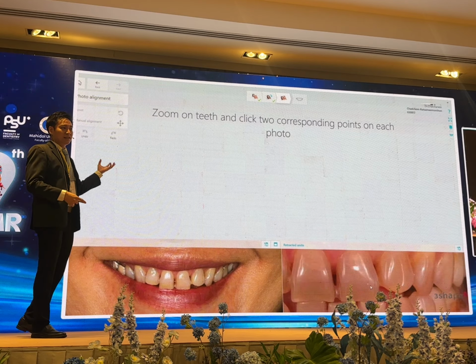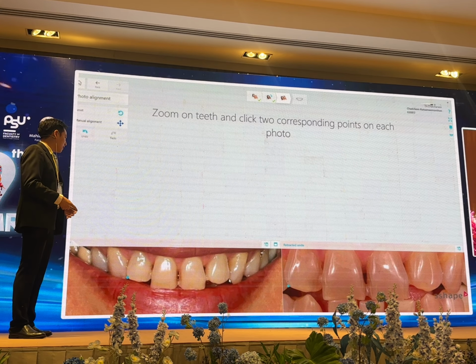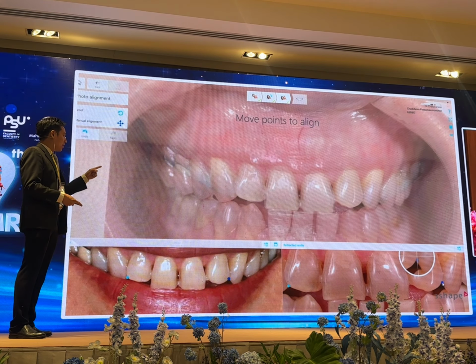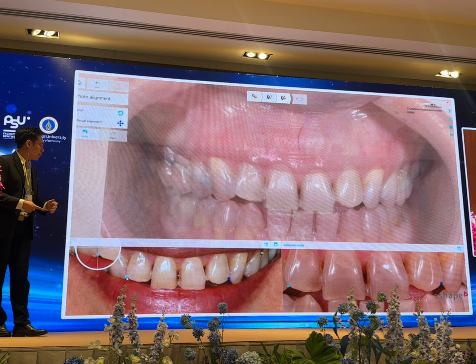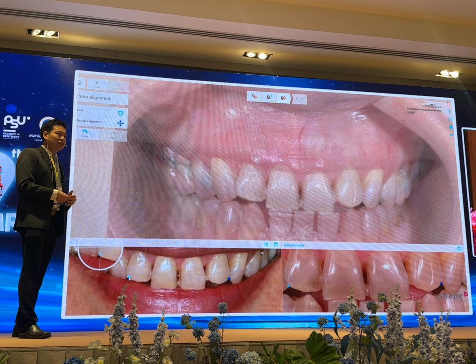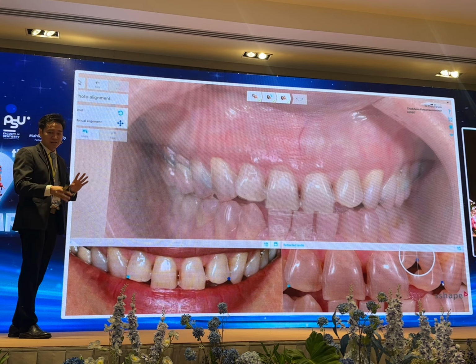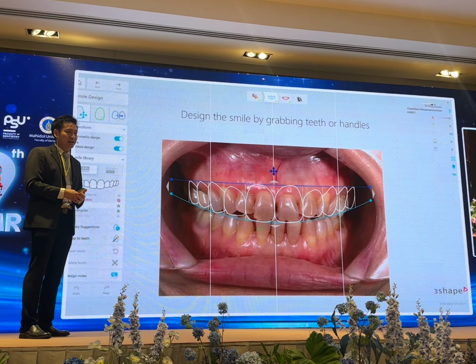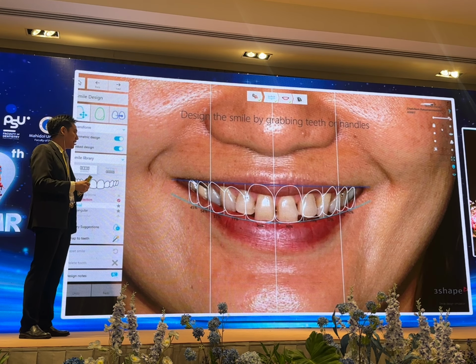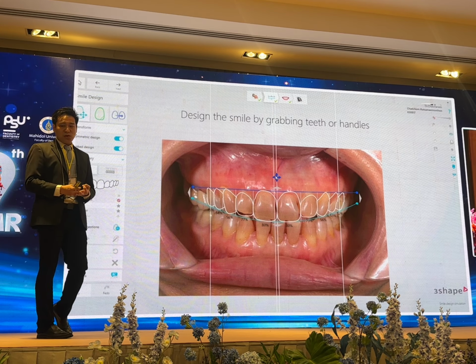We incorporated extraoral photography and merged it with the intraoral photography, like smile and open your mouth and close your mouth. In this way of digital smile design, the 2D smile design, you superimpose the pictures. And after you superimpose the pictures, you can create a design for your patient: either smile line, tooth height, tooth width, tooth proportion.